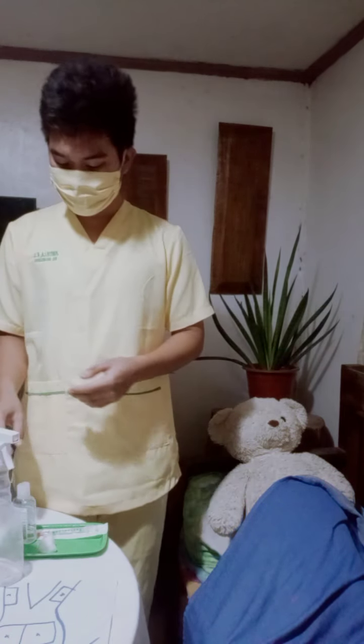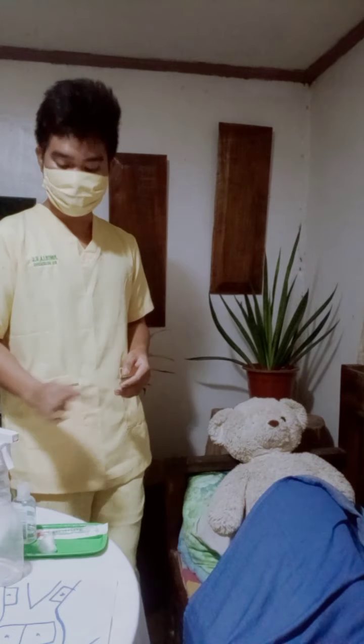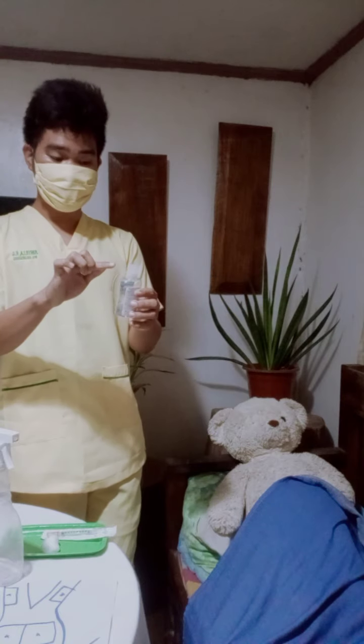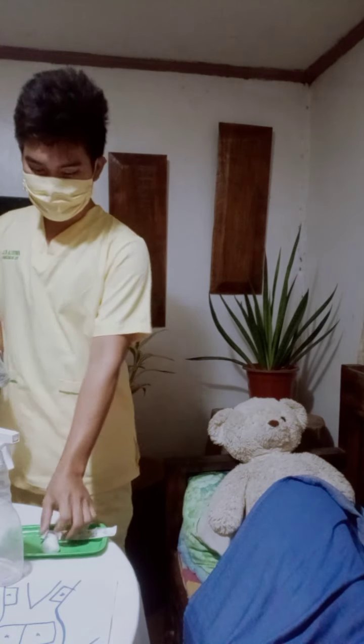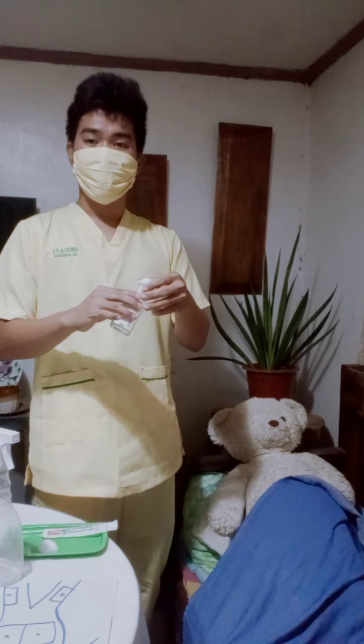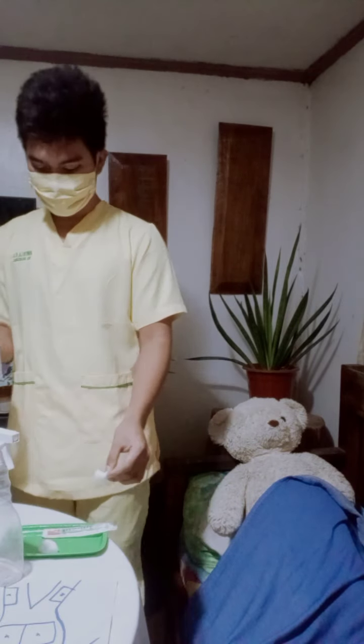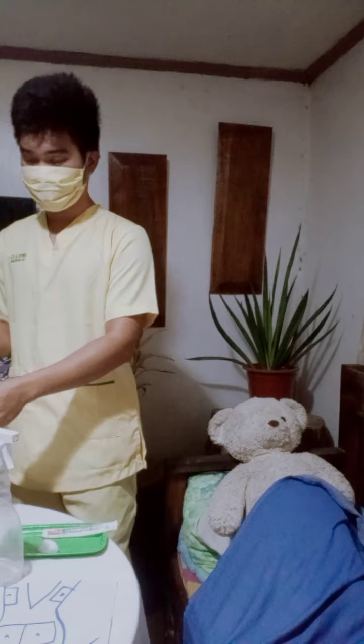The first thing we're going to do is wipe the tip of this vial with the alcohol swab. Do not touch the tip, so as not to contaminate this vial. So we're going to wipe it. After that, we're going to discard it.